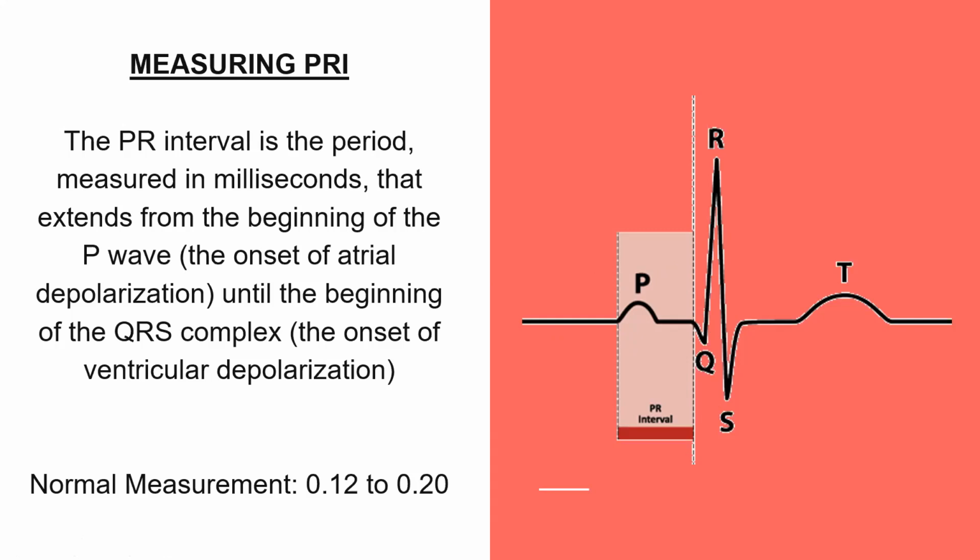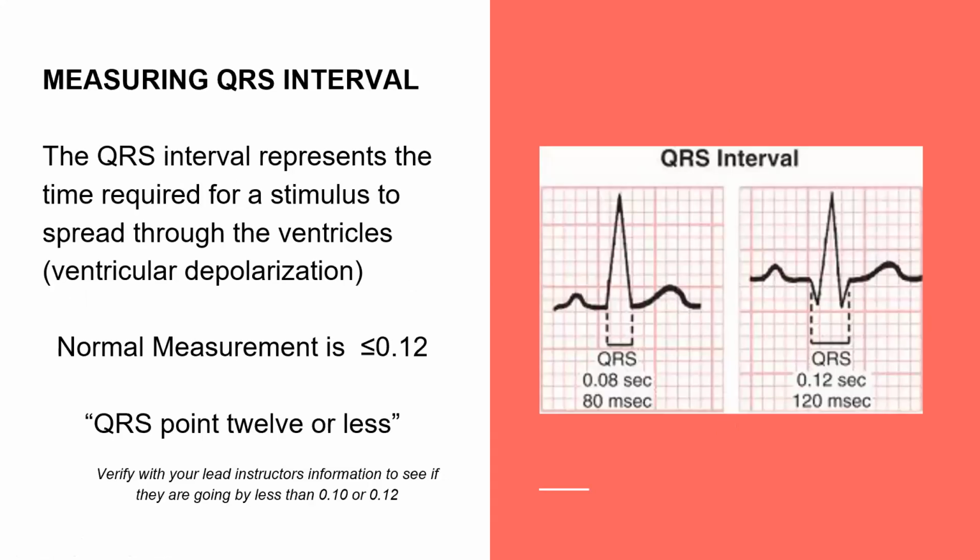And that's also where you start your QRS measurement. If you don't have a Q wave, you're just going to go straight to the R, meaning there's nothing here. It's just flat until you hit right there where my cursor is. So just so you know to adjust for that. Same thing with my QRS. If I don't have a Q, you can't measure it, so you're going to start measuring at the R.